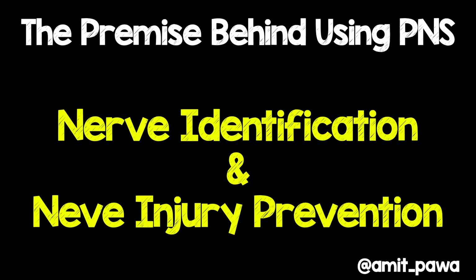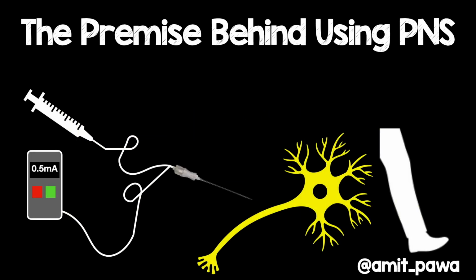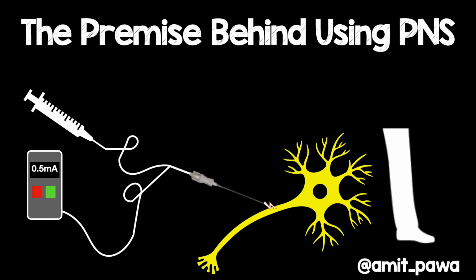The premise behind using peripheral nerve stimulation is to aid us with nerve identification and nerve injury prevention. So you know the deal here. We'll get electricity connected to a needle and we'll approach a nerve. And as that electrical signal gets closer to a nerve, we hit the right spot, we'll get motor twitches.